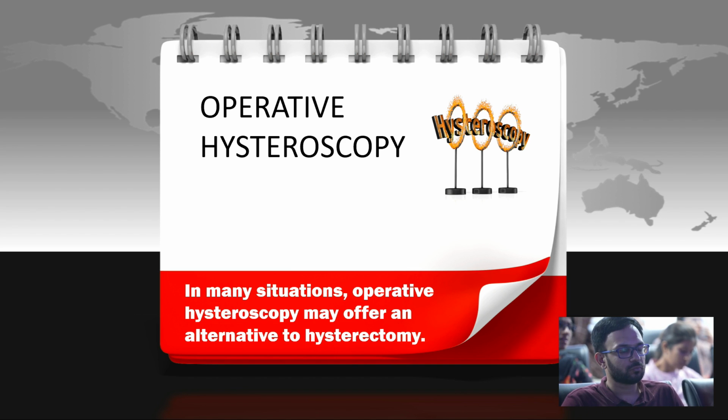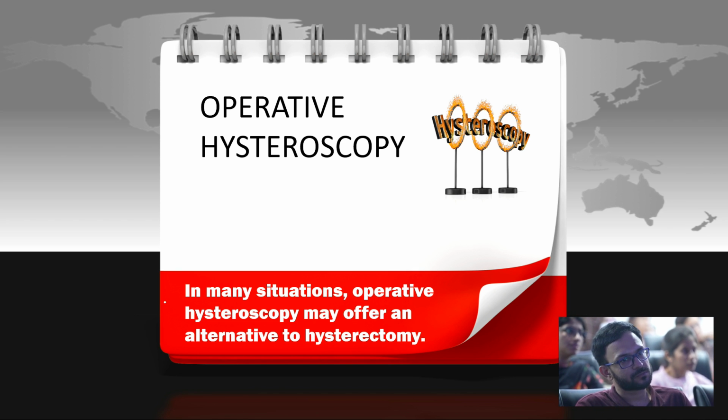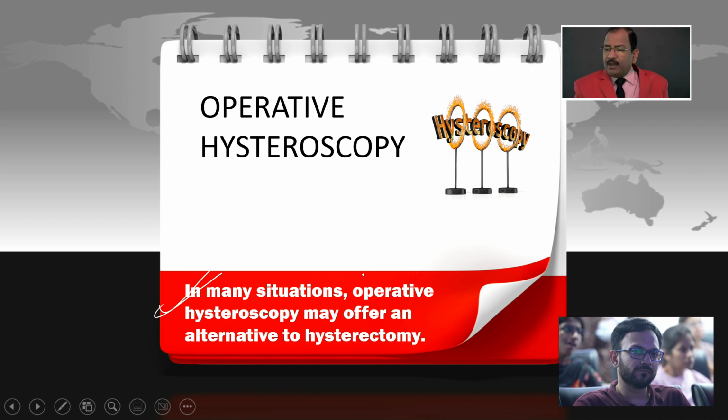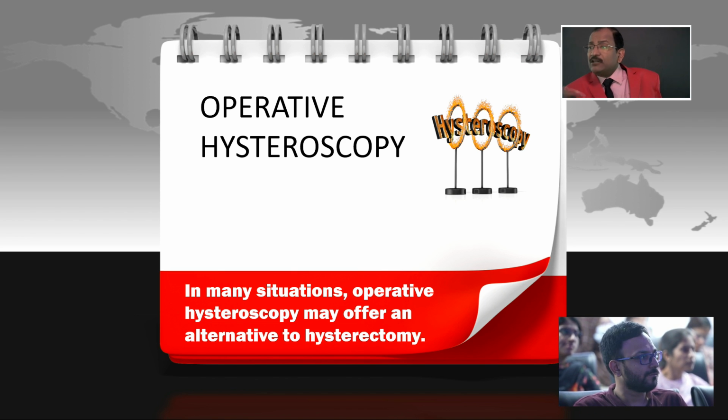Now coming to operative hysteroscopy. Up to here we have considered diagnostic, now operative. In many situations, operative hysteroscopy is an alternative to hysterectomy. If you are good in operative hysteroscopy, you can avoid many unnecessary hysterectomies.